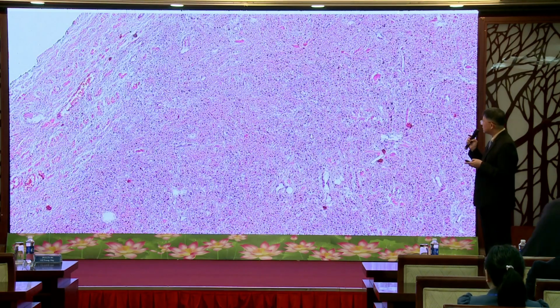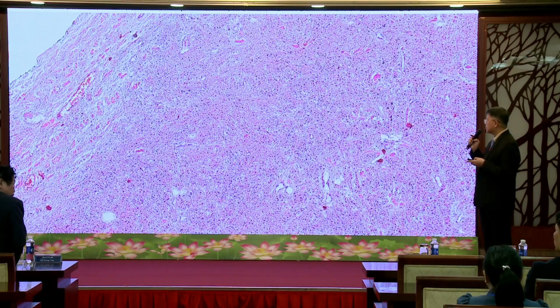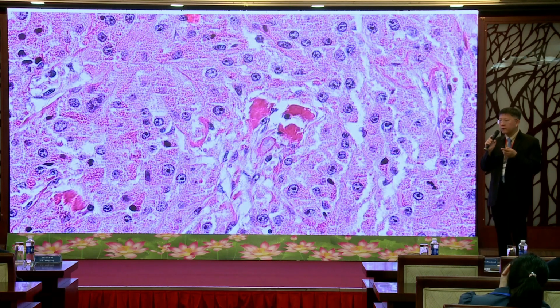The tumor also looks like oncocytic cells, but the key features in this case are that the border of the tumor is quite infiltrative, and you can see entrapment of skeletal muscle, and the tumor cells have pink, granular cytoplasm. Aside from involving the thyroid gland, the tumor also extends to the surrounding soft tissue.